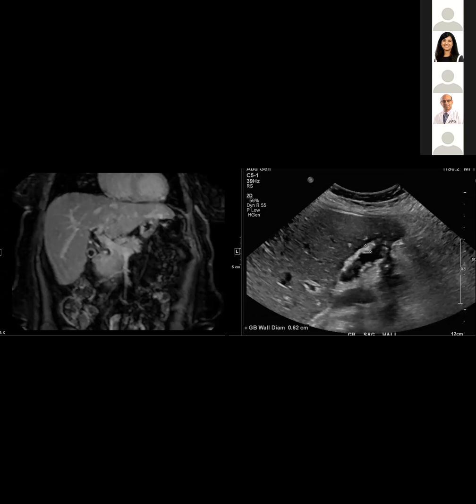And ironically, guys, I have open a gallbladder case from our county hospital that is identical to this. But they equivocated on the CT, and I now have my colleagues beaten into them that if they see on any modality what could be tumefactive sludge versus adenomyomatosis versus gallbladder mass, they come to contrast-enhanced ultrasound. And I literally was just sent the images from the contrast-enhanced ultrasound. Unfortunately, it's not anonymized, so I can't show it to you. It has the patient data burned into the ultrasound images, but it clearly shows a polypoid, avidly enhancing intraluminal mass in a 60-year-old.